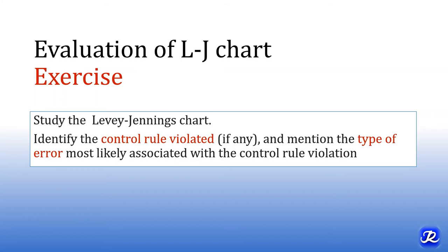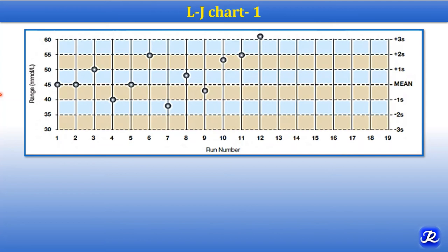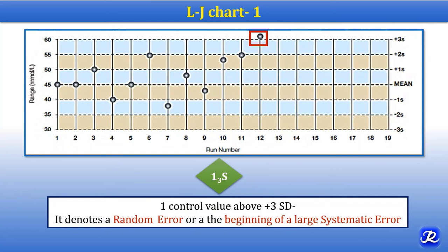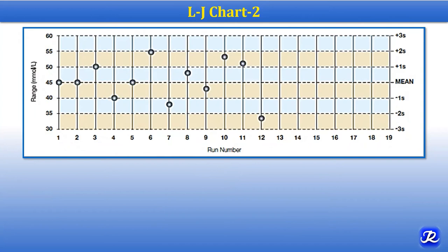Let's evaluate Levy-Jennings charts. The question asks you to study the LJ chart, identify control rules violated, and mention the type of error most likely associated. In LJ chart 1, at one position this control measurement is above the 3 standard deviation limit. When one measurement exceeds 3 standard deviations, it violates the 1-3S rule, which denotes random error or the beginning of a large systematic error.